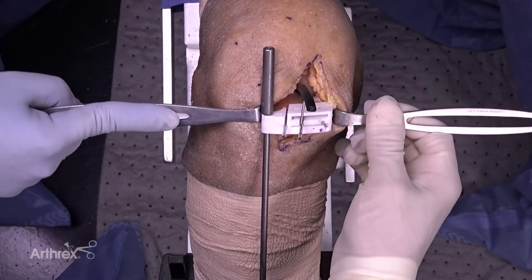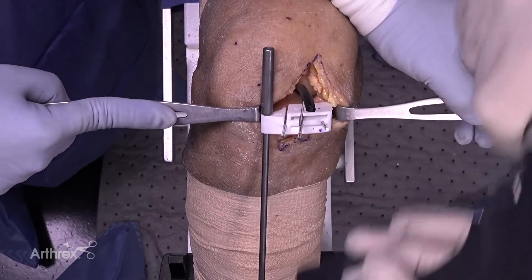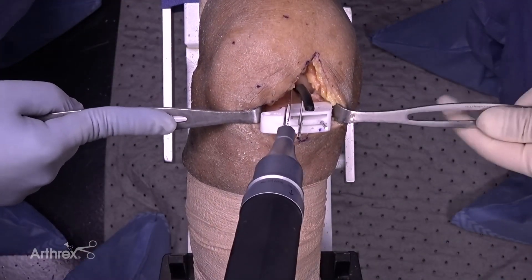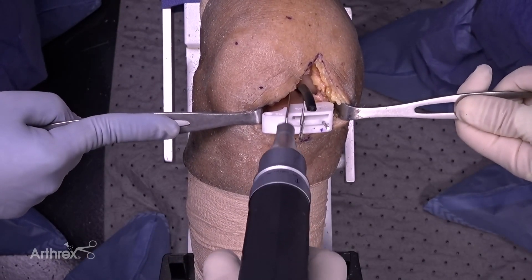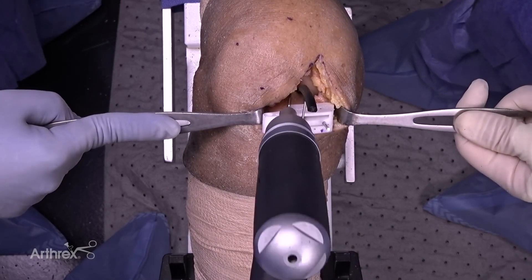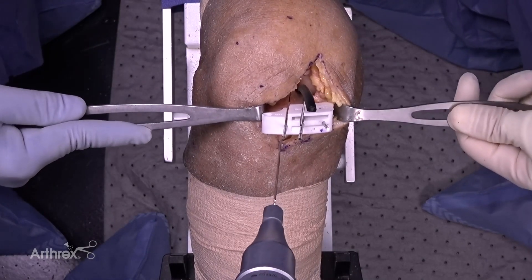Now we are set for our saw cuts. We're going to start with our vertical saw cut. Because we lined this up so well, the saw blade fits right up against the lateral aspect of the medial condyle and fits right down into my slotted side. I've cut down — very nice positioning — and my pin right here has protected me from undercutting.